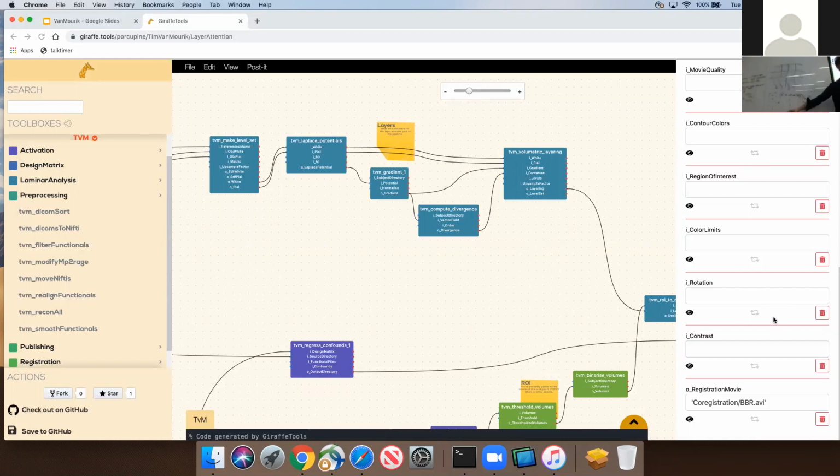The volumetric layering sets up this design matrix. John, please. So the Weiner paper, the paper that describes the volume. Yes. So, well, sorry, I missed. What did they set up? They, right. So, right. You're right. I wasn't quite complete there.